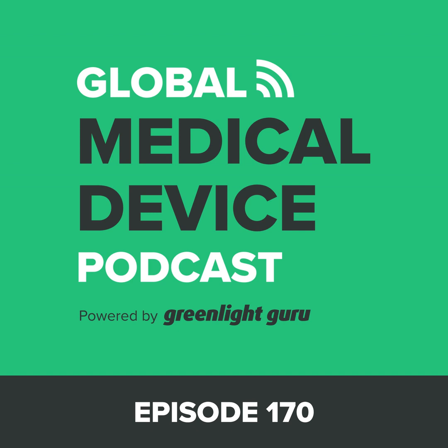And then if there are no possible harms, then you would be a minor level of concern. For a software as a medical device, this probably isn't ever an option. I think this would probably be more something for software that's contained in a medical device that doesn't have an impact on the intended use.